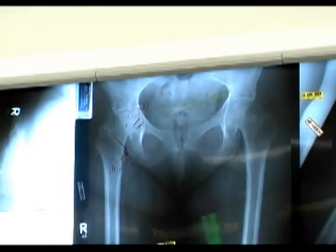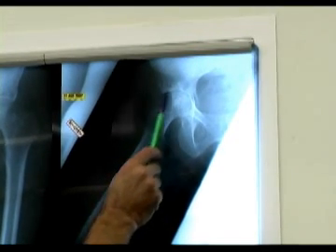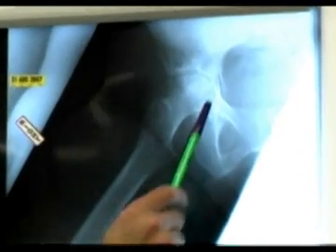That can be confirmed on the Lowenstein lateral view, which shows a very large collapsed fragment of the superior head, a loose articular fragment within the joint, and central arthritis. I would classify her as a Steinberg stage 5 or 6 avascular necrosis.